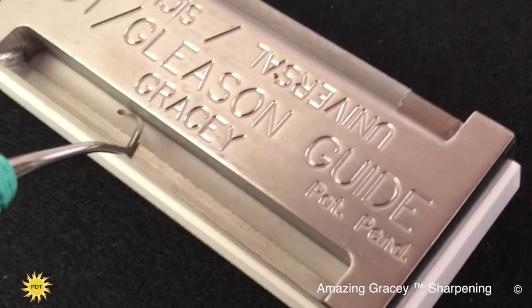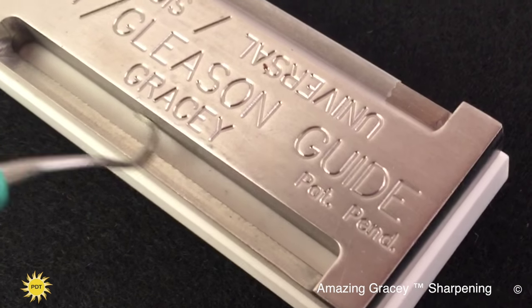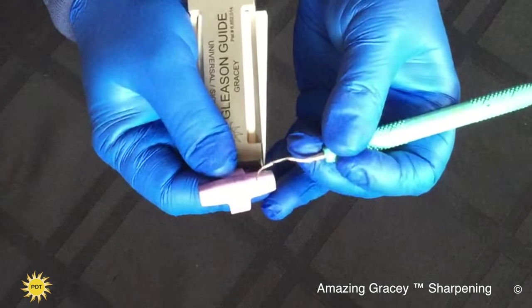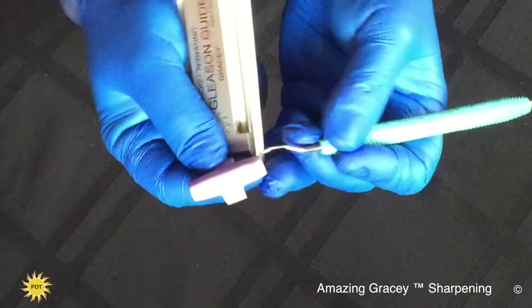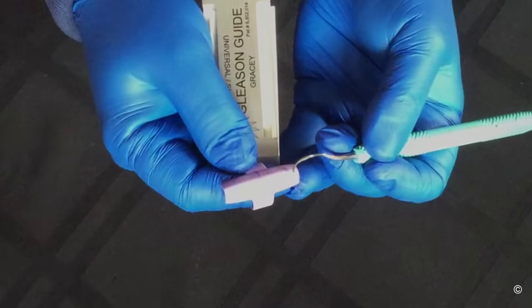So again, just to remind you: stop, rest, glide. Always making sure that you stop to test so that you don't over-sharpen the instrument. Thank you.